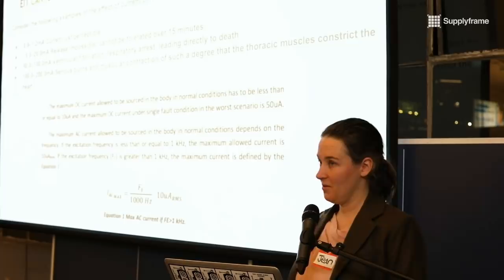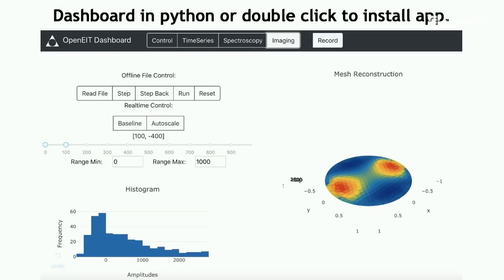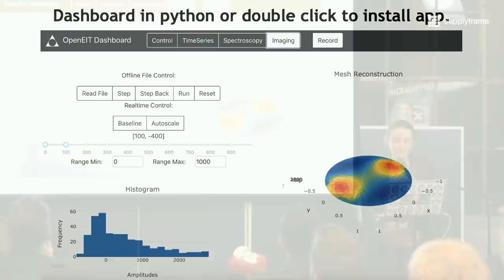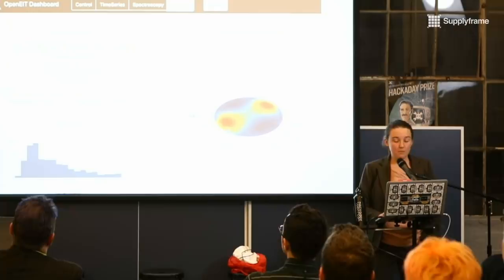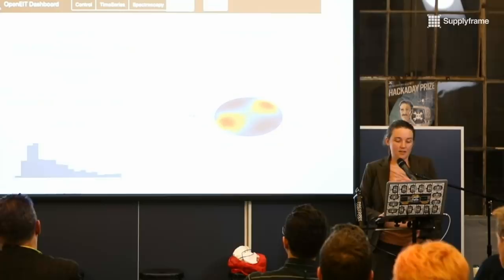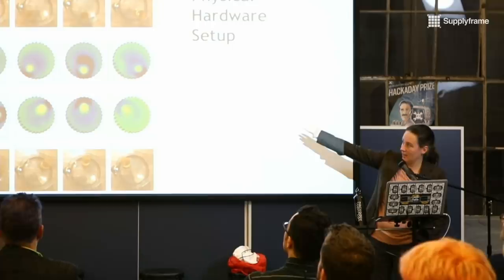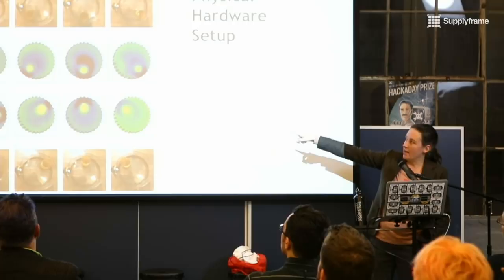This is what the dashboard looks like. It does a few different things — it does the imaging, which is the basic demonstration that you can do biomedical imaging in a really portable, small, very cheap way. It does spectroscopy and also gathers time series data. Here's an example of how it works: I've got a tank with a cup in it, I'm moving the cup around, and I'm localizing where the cup is only through current.